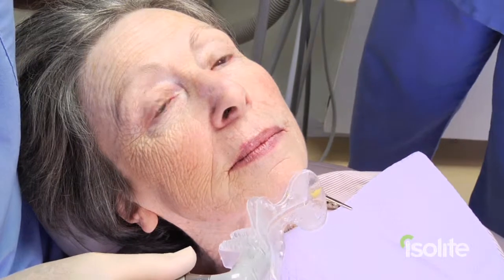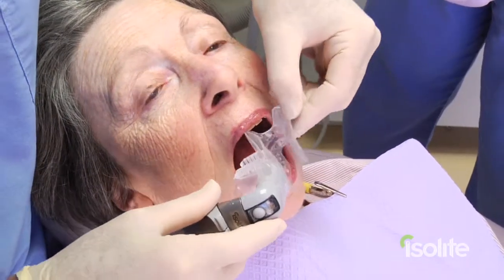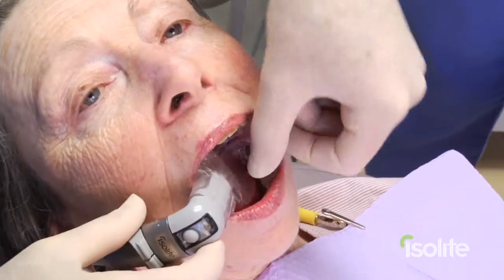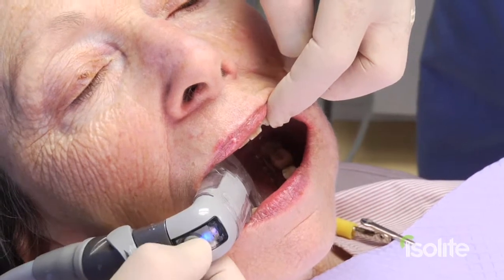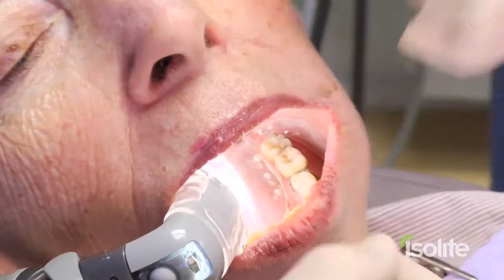Let me show you how utilizing ice light makes bonding and cementation of your restorations faster, easier, and more efficient. Place the ice light in the mouth, close down gently for me, and isolation is achieved in about three seconds.